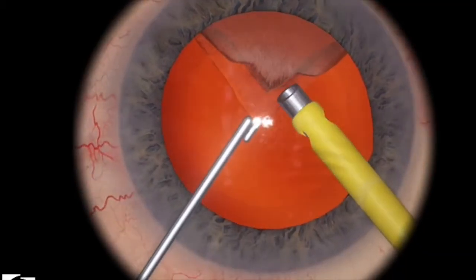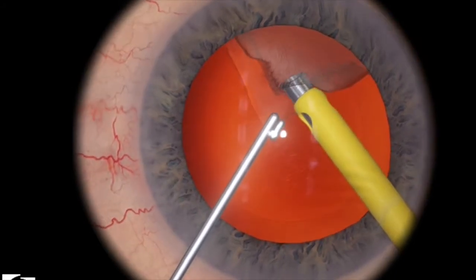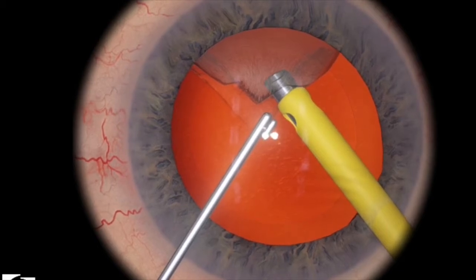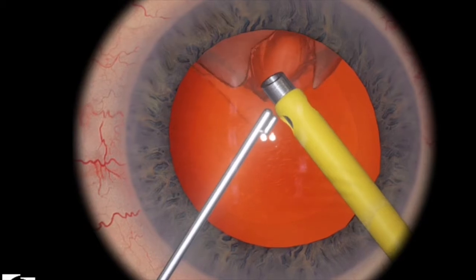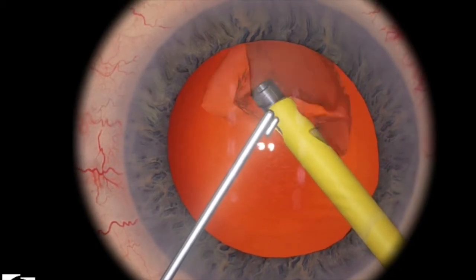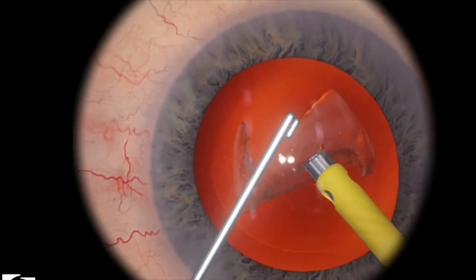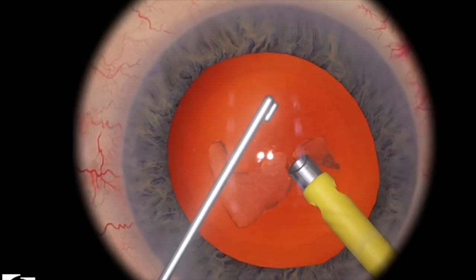So here I've entered the eye and I'm trying to use a little bit of aspiration to engage the piece. And then I'm trying to bring it to the zone of safety, or the center of the eye. Here I've accidentally used a little bit of phaco energy — that's okay. I've brought the rest of it to the center of the eye and now I'm just using a little bit of ultrasound energy to remove the lens piece.